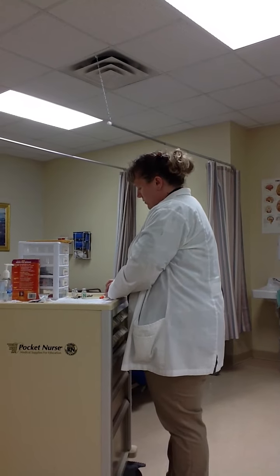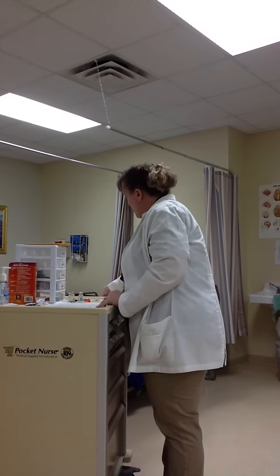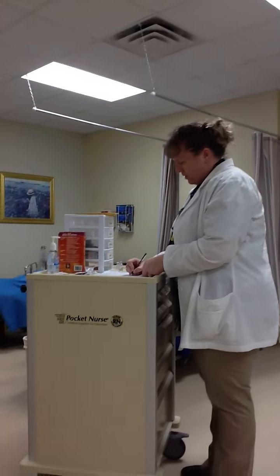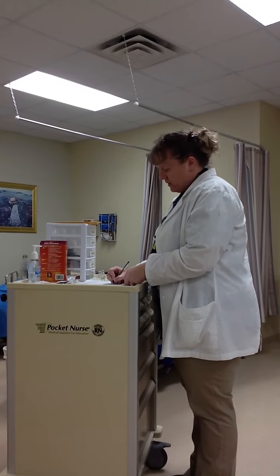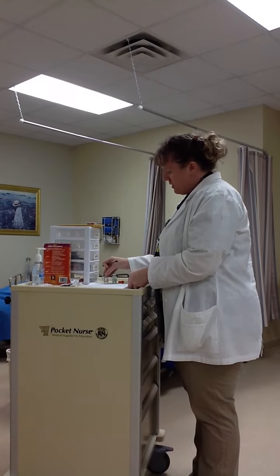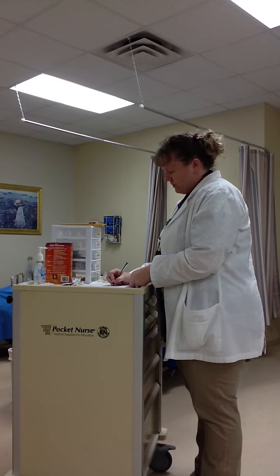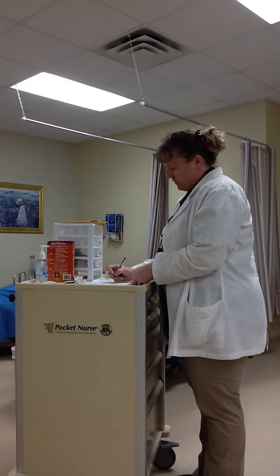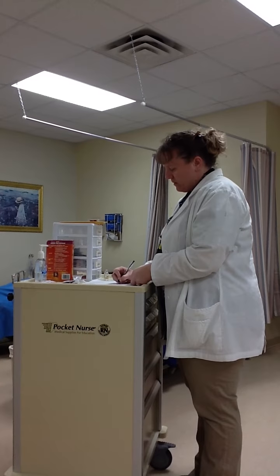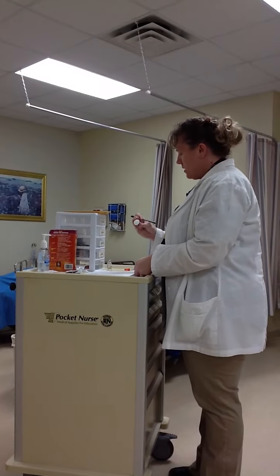With it laying down, I will recap that and set it. I'm also going to make my label. I'm going to show regular insulin, 4 units. That expires December of 12. And I'm also going to show NPH, 24 units, which expires in 2020.